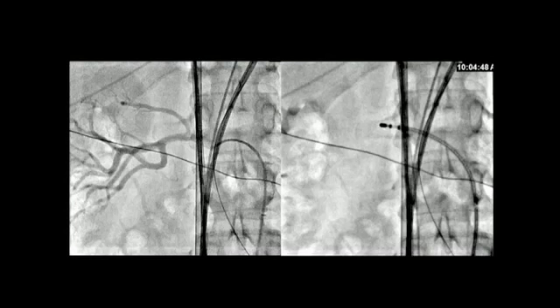In addition, in this case, we did renal denervation. We have used this technique for VT and been part of a couple small case series using it for VT, but numerous centers have used it in combination with PVI for AFib. Dr. Steinberg and his group have done a number of these. We've done this selectively in patients that have had refractory hypertension in addition to their difficult to control AFib, using a standard irrigated tip ablation catheter and NAVX or CARTO mapping of the renal arteries.